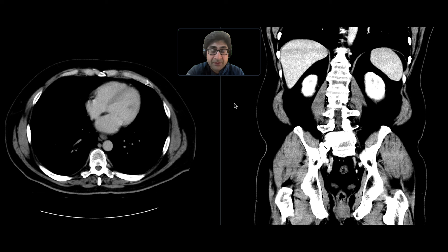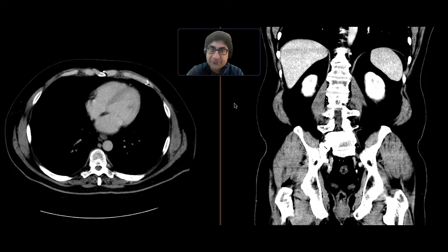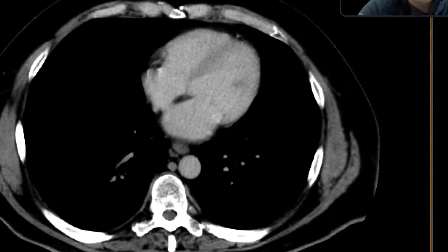This is a patient who came in after getting a colonoscopy, which showed some abnormality involving the cecum and appendix orifice, and so they wanted to get a CT scan to try to figure out what was going on.